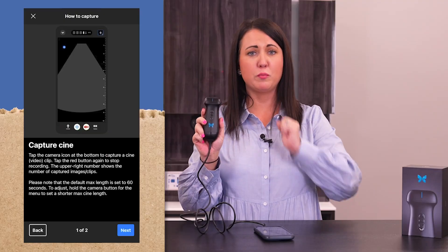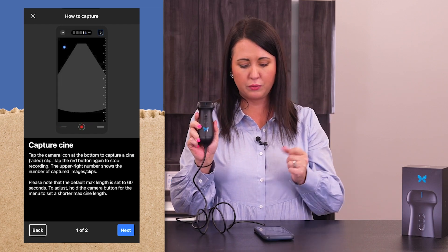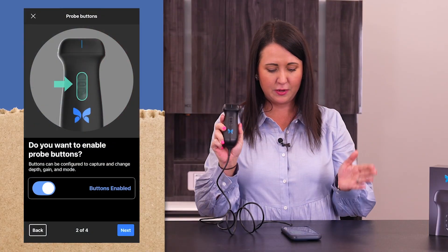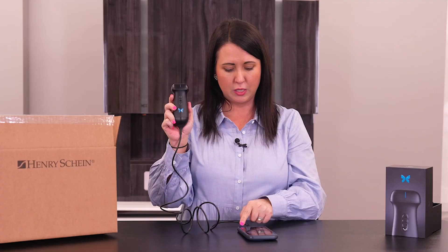I love that it gets into even more detail — how you're going to capture a cine loop, which is a little small video. That's a great way, especially if you're injecting any kind of medicine, you can see that injection going in and record it. It's going to tell you how you can configure these probe buttons so that it works best for you in your practice. You can have the probe buttons turned off in the app, or turned on and have each button customized.